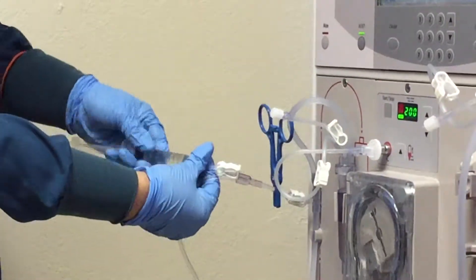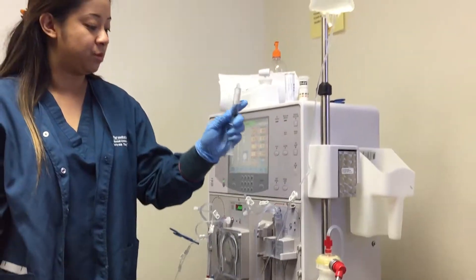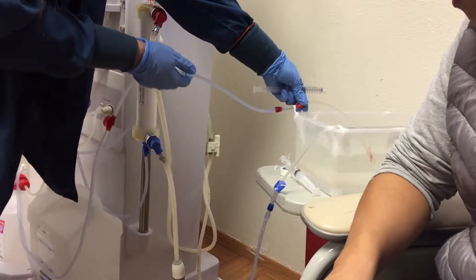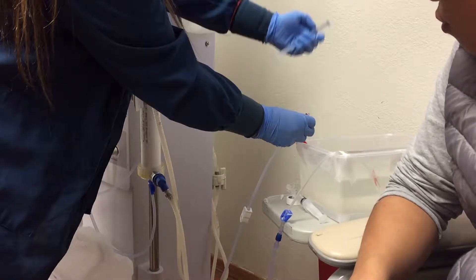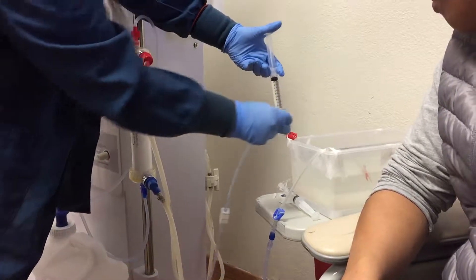Clamp. Treatment's completed. First thing you do is you stop the blood pump. You're going over to your arterial line. You clamp both needle lines and you're disconnecting it. You're going to put your 10 cc's in your arterial needle line.